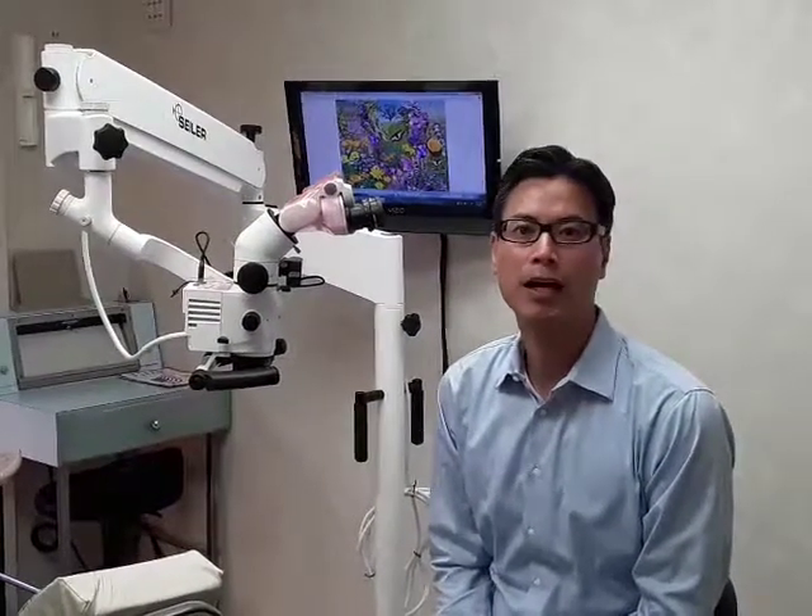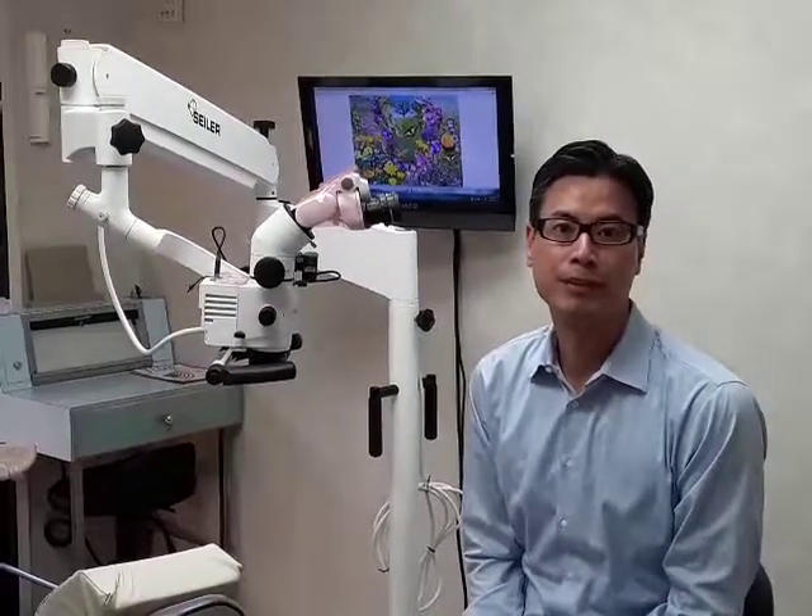Hi, my name is Dr. James Tran. I'm from Thousand Oaks, California. I'm here to give you a quick review of the Seiler scope. We purchased this about two months ago and have been really happy with it.